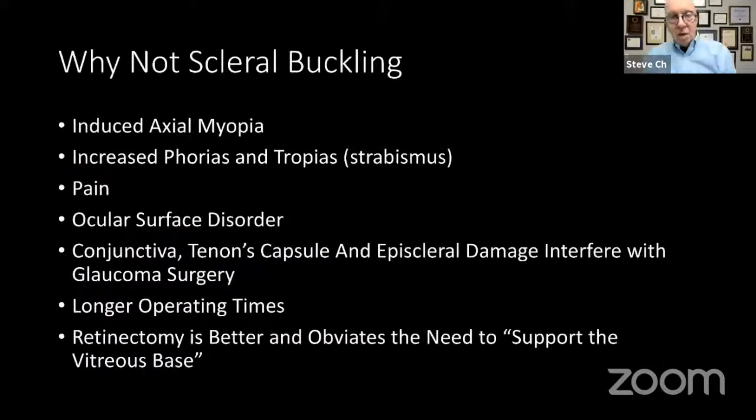Lastly, why not scleral buckling? There's a funny story that's a bit derogatory toward Robert Machemer, who got us started with vitrectomy many years ago. I saw a letter about a patient. He said the retina is substantially reattached. It was a letter to the referring doctor. It was completely reattached on the buckle, and all the retina posterior to the buckle is detached. The part posterior to the buckle is the part you see with. So they put a giant buckle in and look in there and say, oh, it looks great. And then they get PVR posterior to the buckle, and you've got to do a retinectomy anyhow.